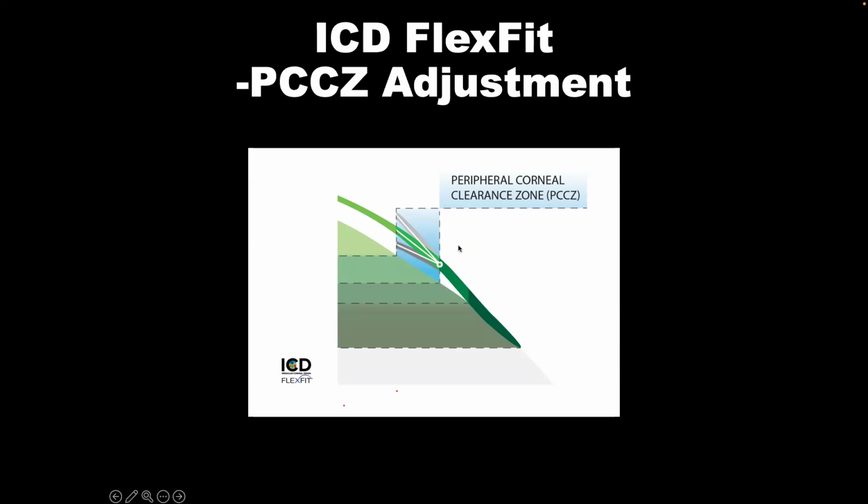So again, you can just manage those changes and compensate for losses or gains that you are doing with each zone. You have the ability to make the lens as you wish, but my suggestion again is try not to make that many changes. And if you are over 500 microns, just go back down to another lens and then reassess the fit.